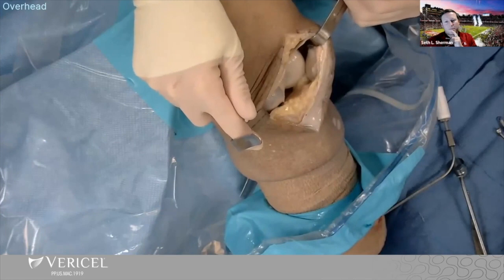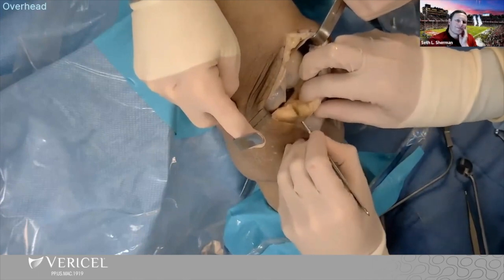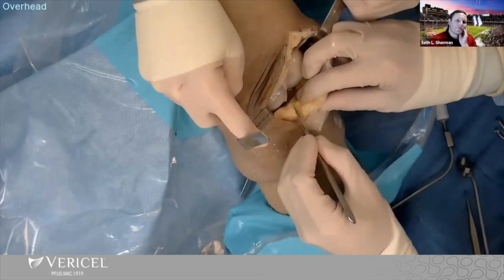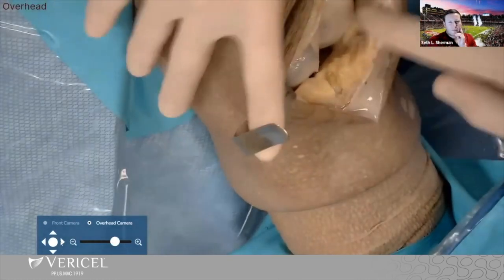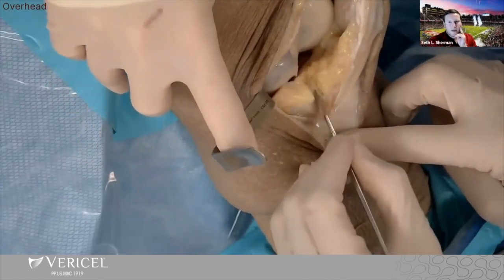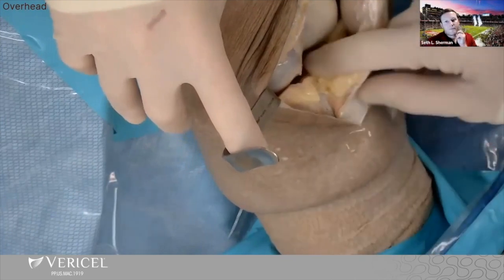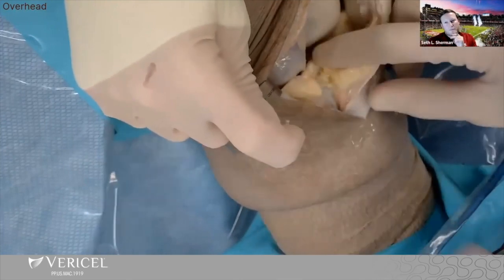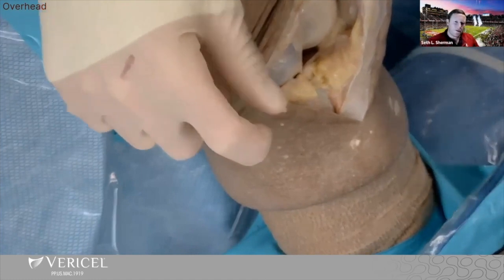You take the fat pad down all the way. You can see we're taking this down layer by layer, and watching it. Sometimes my assistant from above can tell me how close the meniscus is. When I get right next to that meniscus, I start coming across. You can come down lower and release those fibers — it opens up even more. You can get almost to that approach right next to the patellar tendon. In a revision situation with a scarred fat pad, you can start going across. You've got to be careful because when you take it down there's going to be a lot of bleeding, so I really try not to manipulate it as much as possible.